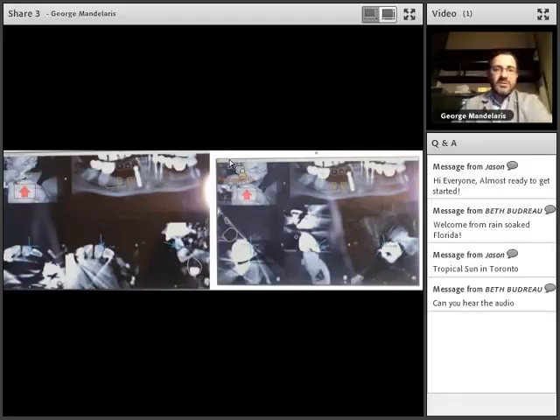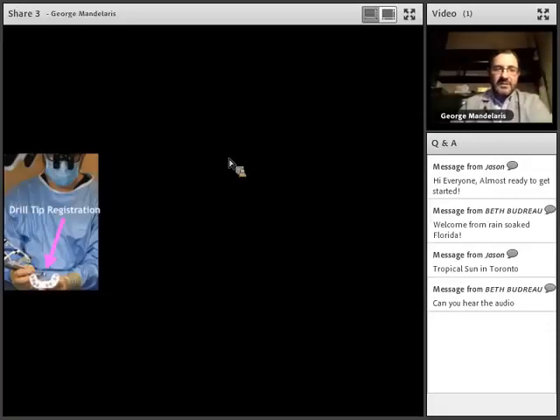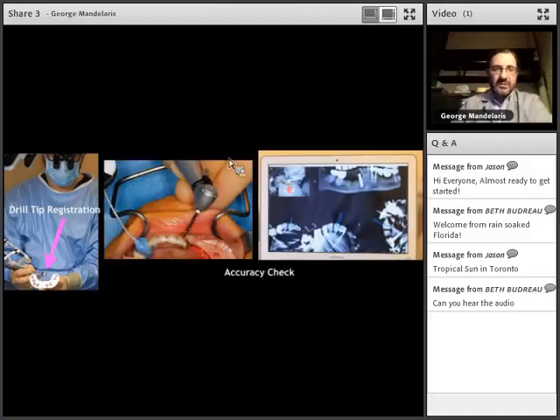Now this is a little different today because we're using a ball tip instead of a little metal tip as you are indicating here. With that, it's basically an arrow as we discussed earlier, but today with the ball tracer, you're going to look at something that doesn't have an arrow. You'll see actually a little ball that represents more of what you're using to do your contact mapping. Again, the calibrator is a little different. Today we're using that white jig that I showed you earlier to calibrate the access and do our tip registrations, but here you can see the tip being registered on this lower right lateral incisor, and there's my plan. So an accuracy check now is being done with the drill, and you'll notice that I'm not in the pulp of the tooth.